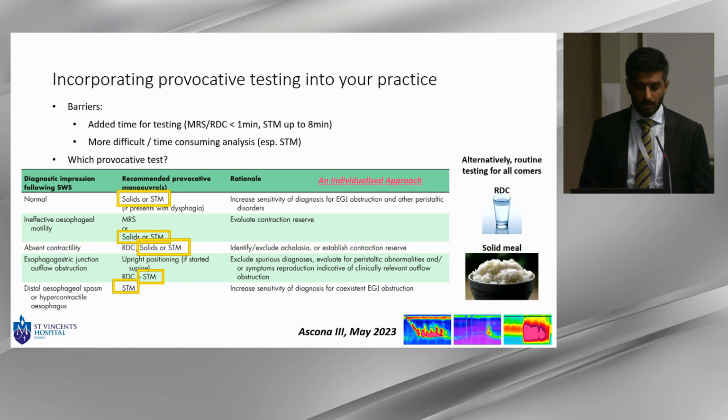So, of course, the alternative is to just have a routine approach for all comers. At our institution, we do the rapid drink challenge and solid meal in every patient. Thank you.